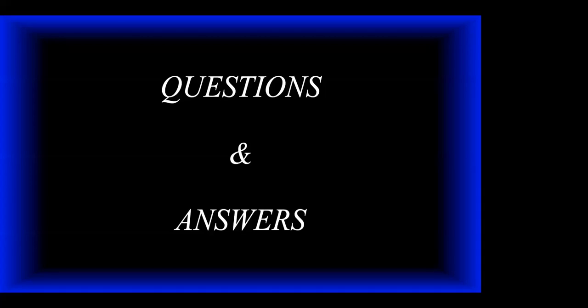And if you look at biomechanics, even smaller diameter implants, a 3.0 or a 3.5, have better stress distribution. So to answer your question, can it work? Yes, we've done mini implants for 30 some years. We used to do them as temporary implants back in the 90s. But I believe it's more predictable, and the prosthesis has fewer complications, with regular size implants.